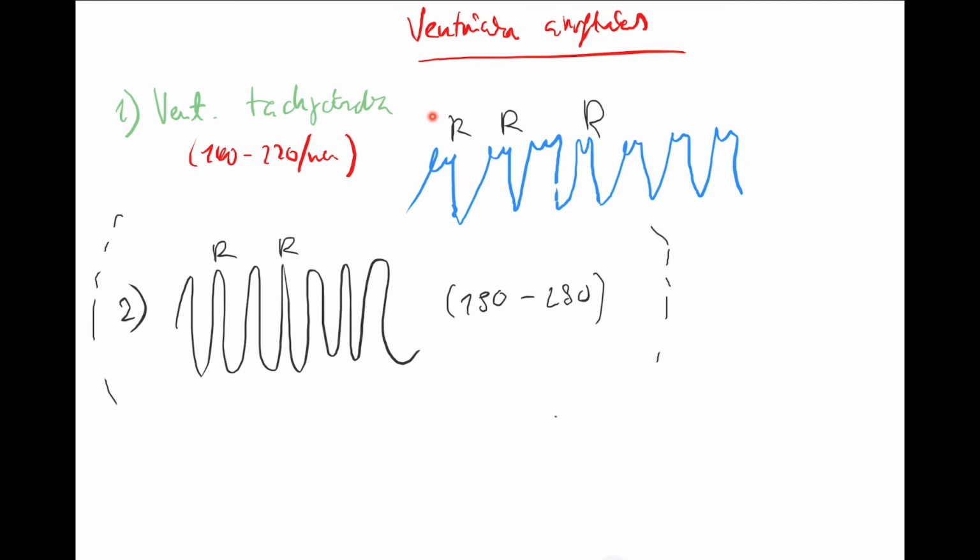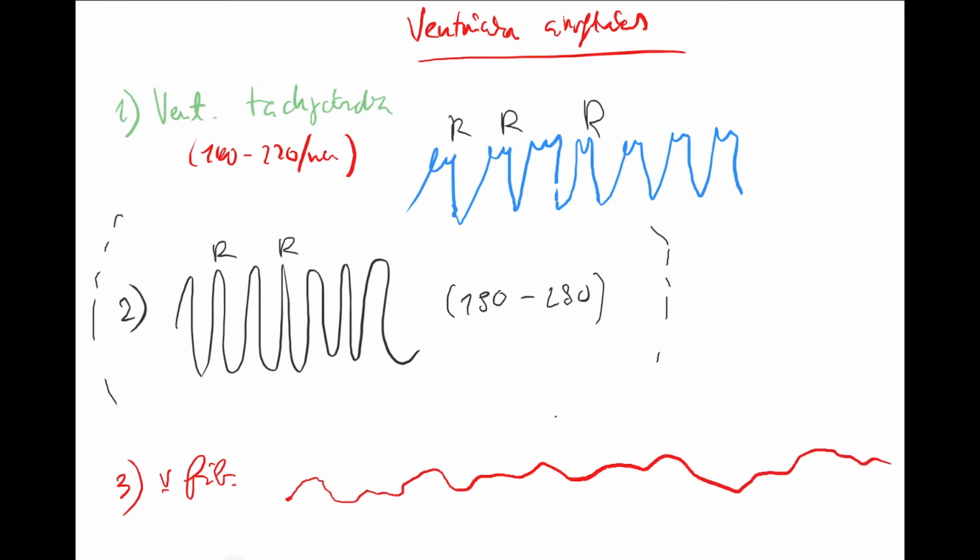And with just the same machine, you also do defibrillation. Okay, this is in case you're having a V-fib, and V-fib looks like this. You don't see any R's over there. It's totally like nothing. It's not a line. It's like this. And in this case, you defibrillate. Okay. So over there, when you push the button, it just sends the shock right away, because there are no R to be read. Okay, this is cardioversion. So remember cardioversion.